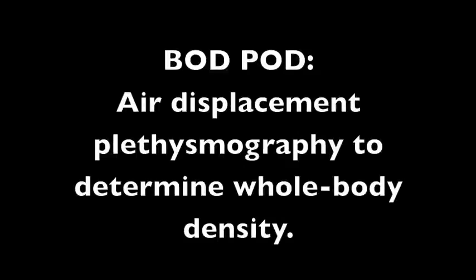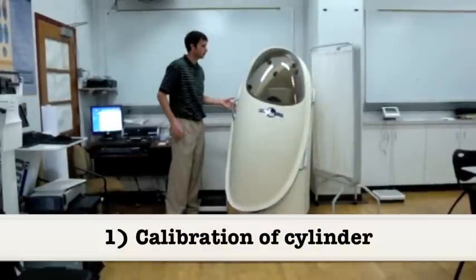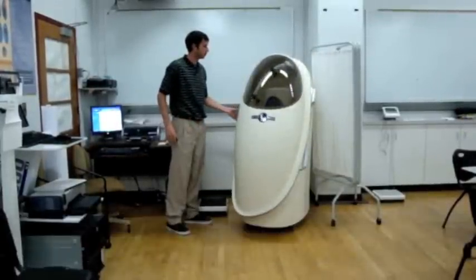The BOD Pod estimates body volume by measuring air pressure. The BOD Pod must first be calibrated with a 50 liter cylinder.